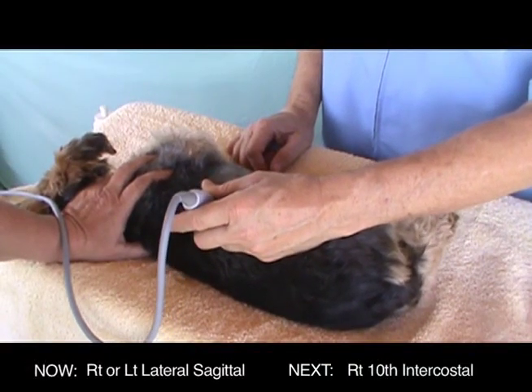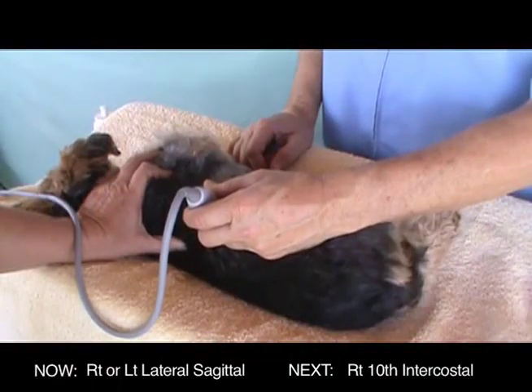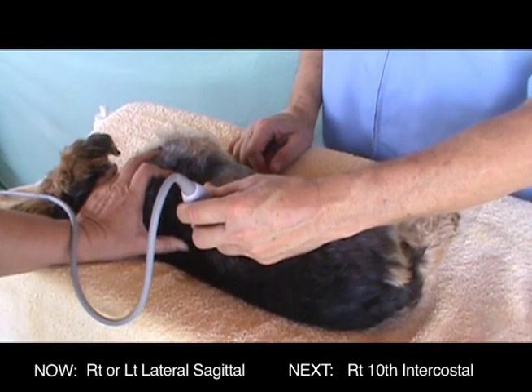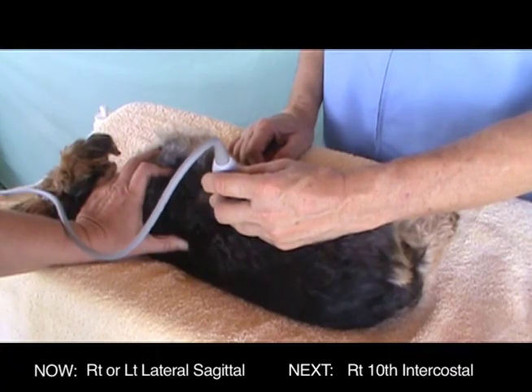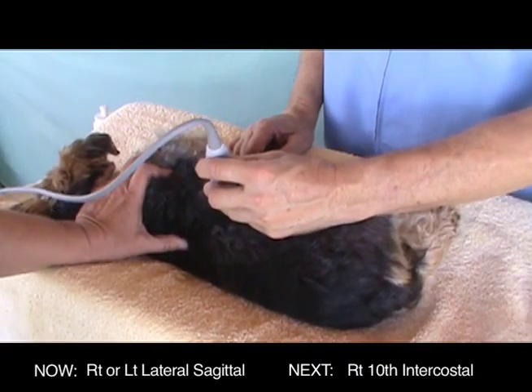The transducer could also be placed over the left ribs, wherever it needs to be to see the gallbladder. Intercostal views may be necessary if the liver is very small or cirrhotic. With cirrhosis of the liver, the gallbladder may only be seen from either the left or the right side between the ribs.